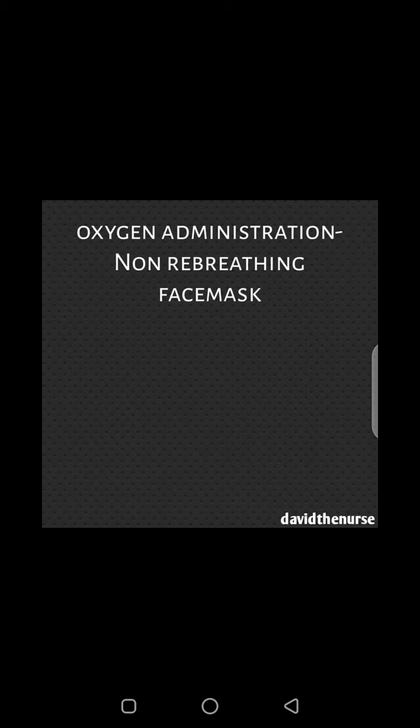In this video, I'll be talking about oxygen administration via non-rebreathing face mask. Now, why do we call it a non-rebreathing face mask? The reason is that when administering oxygen using a non-rebreathing face mask, it will prevent the rebreathing of carbon dioxide by the patient.